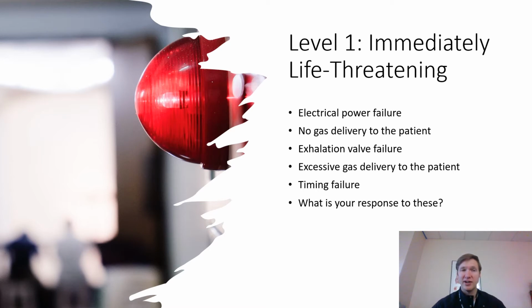Low gas source alarms usually help us, especially if the gas source is not functioning. If for some reason the hospital area is shut down, like the gas source is shut down, we need to know sooner than later, because the microprocessor ventilators usually rely on high pressurized gas to function. So a lot of ventilators don't have a built-in compressor that they can use. So we need to get some sort of good high pressure gas source.